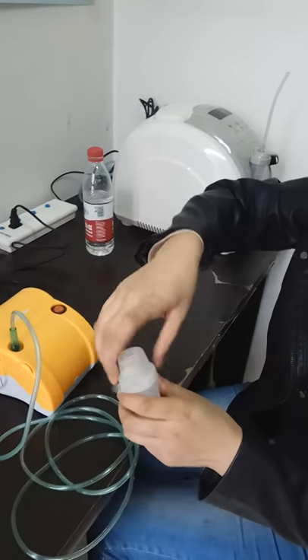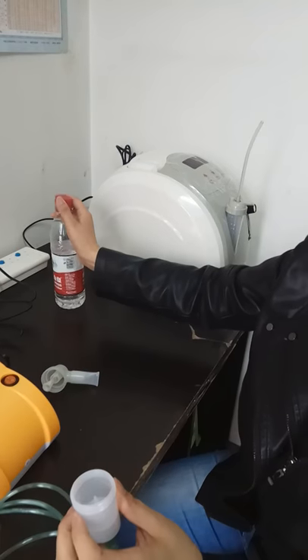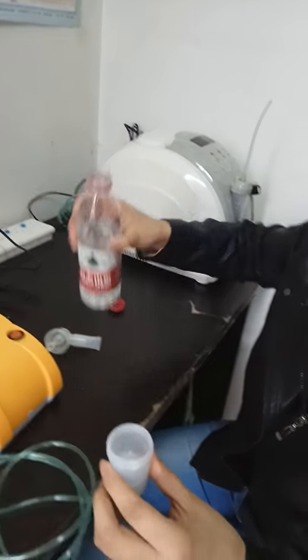Second, open the cap or cup. Add medicine liquid to the cup.